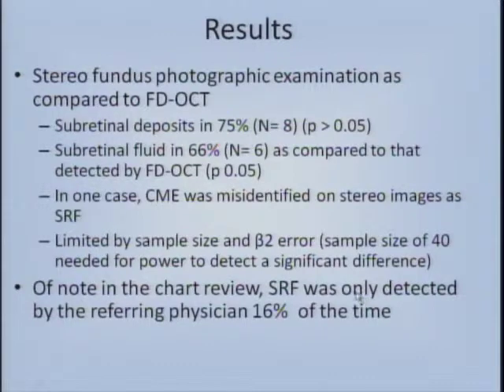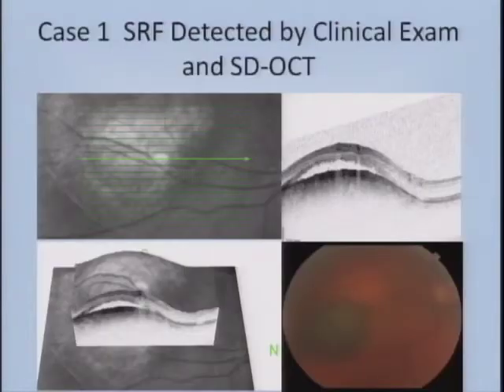Of note, by chart review, subretinal fluid was only detected by the referring physician in 16% of cases, so trained retina specialist versus the referring doctor, there's probably some significance there. So just an example, this is a subretinal fluid that was detected by both the clinical examination as well as the OCT. The subretinal fluid is located here.